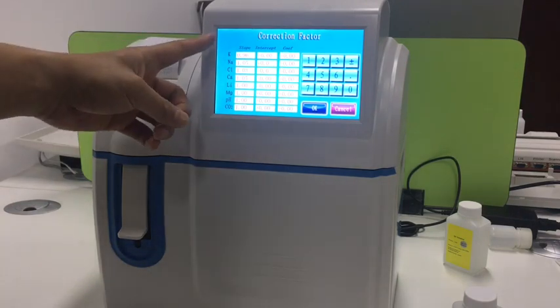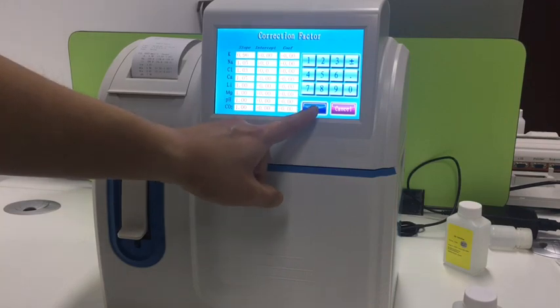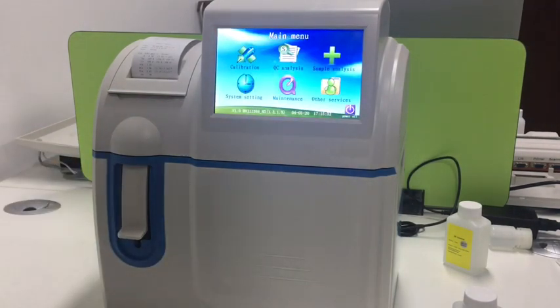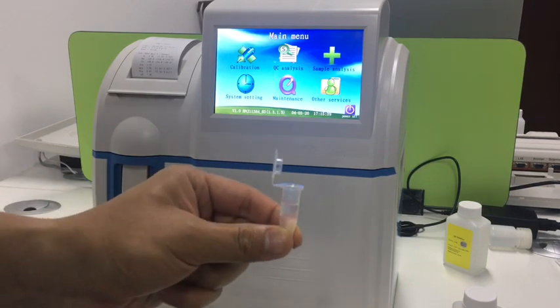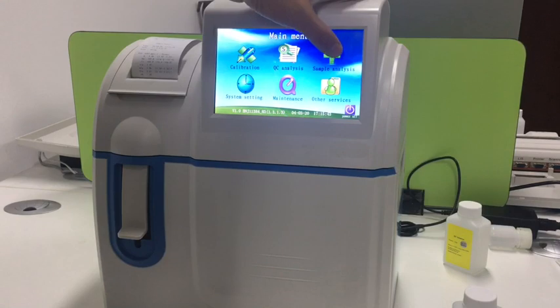It will correct automatically. Here it shows the correction factors obtained for each parameter. Press OK, then we can use the rest of the solution to run it as a sample to do sample analysis and check stability.